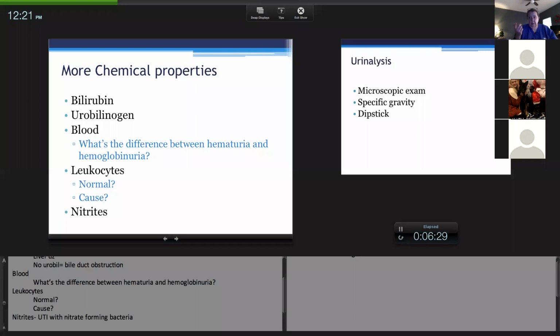Blood is usually present with an infection. If you've got a raging infection, bacteria, because if you've got white blood cells and then you see a whole lot of bacteria, then you know it's probably infection. If you've got white blood cells and no red blood cells and no bacteria, it could just be from inflammation.